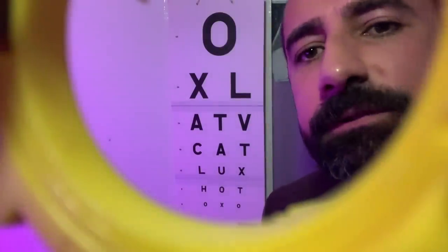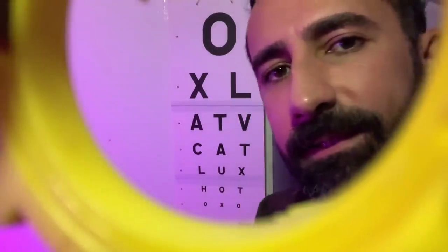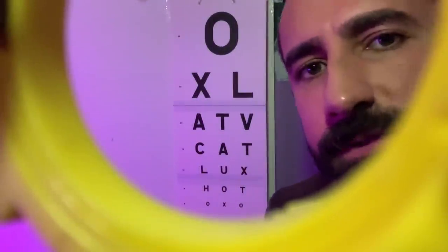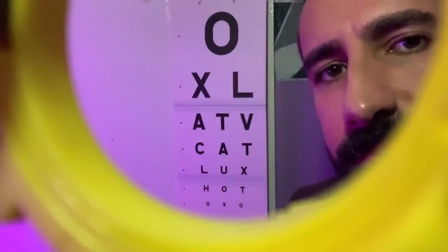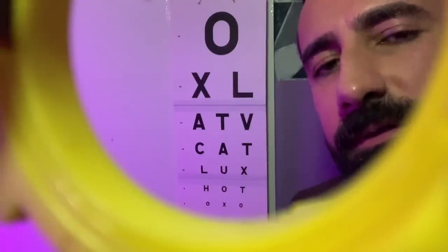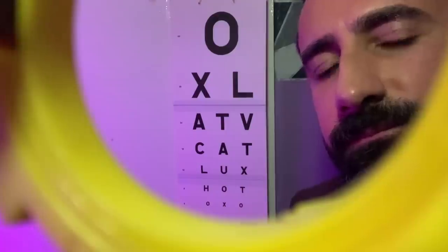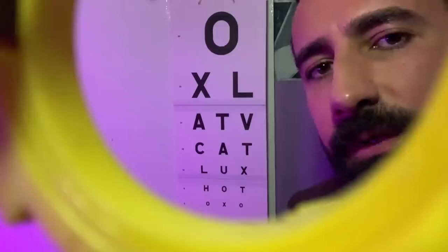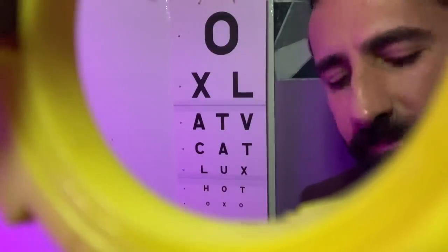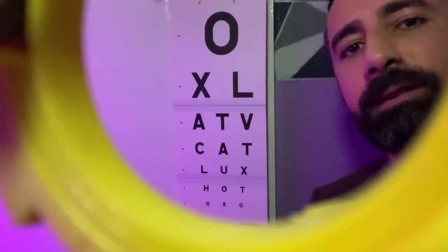Okay, so I think we should do some subjective refraction, showing you some lenses to see if we can make the letters a little bit clearer for you. As you're looking at the letter chart, what is the smallest row you can read for me, please? And the next row down if possible. Just read that row left to right for me now. Good. Okay, as you're looking at that row, I'm going to present some lenses. Just tell me if that row is clear with or without the lens.